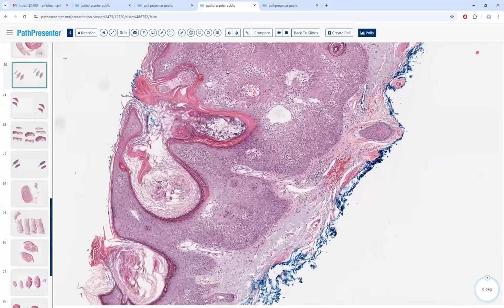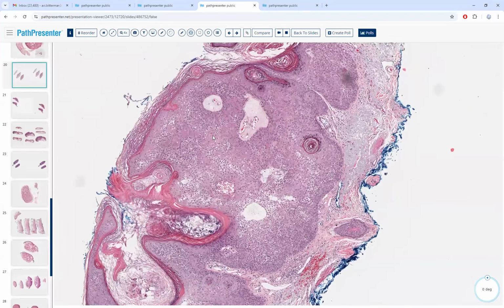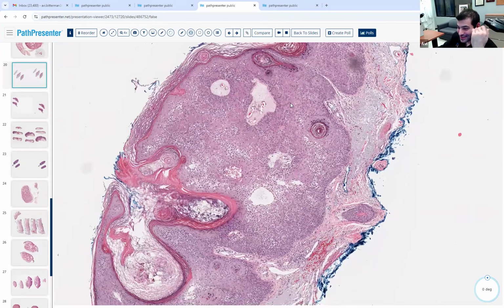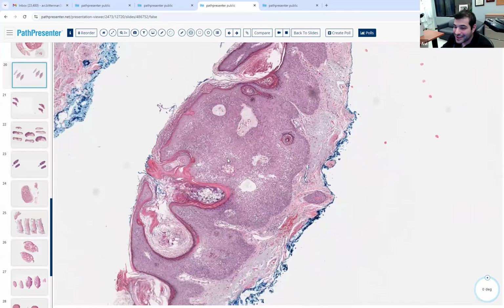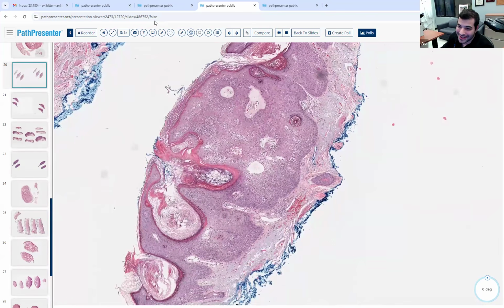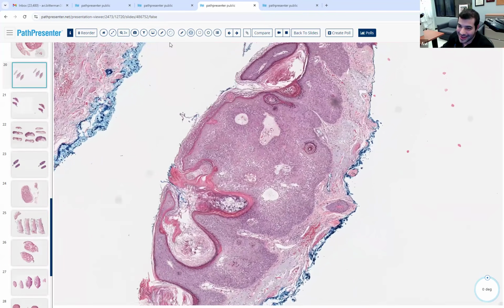I think this entity, I'm really confused because I only can think of one picture of it and it's an Elston. That inverted follicular keratosis. Yeah, IFK, that's exactly what this is. Inverted follicular keratosis. So it kind of looks like a seb, but it's more upside down than it is right side up.